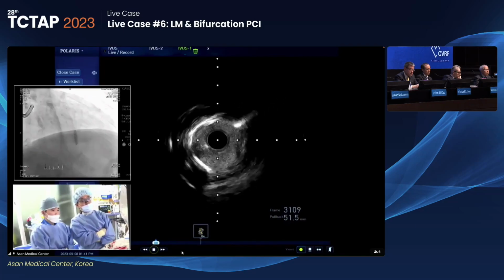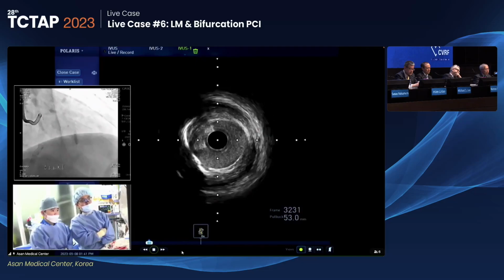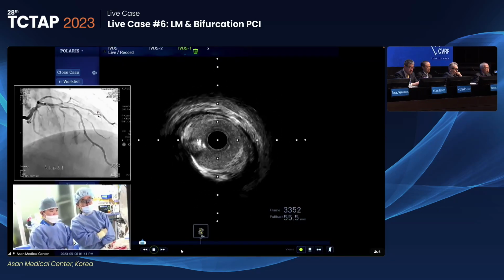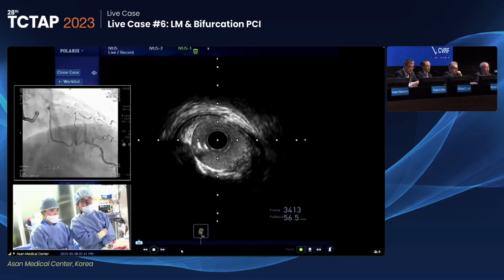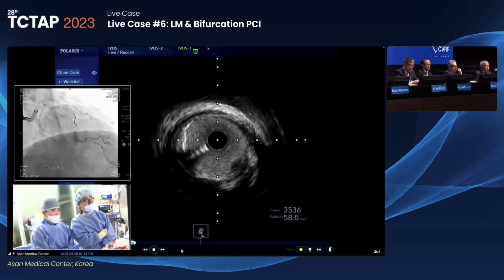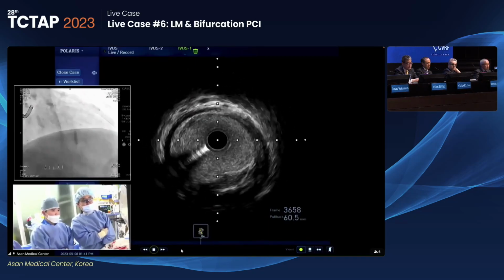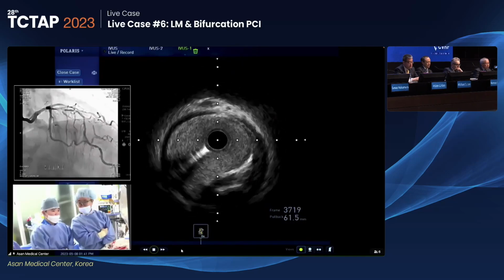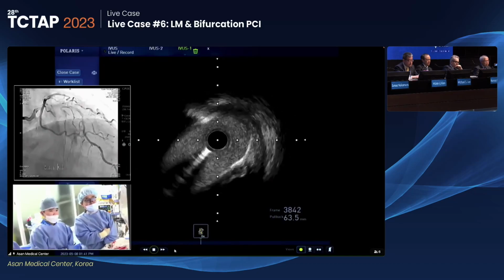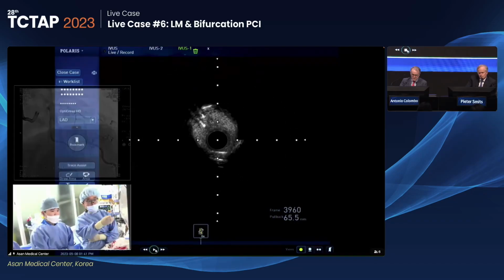Here is the distal left main, and you can see plaque burden at least more than 60%. Vessel size of the left main is more than 4.0, and the plaque extends nearly to the shaft part over here. This is more than 5 or 6 diameter in the left main, and the plaque nearly extended to the main ostium. Also, we checked the ostium.